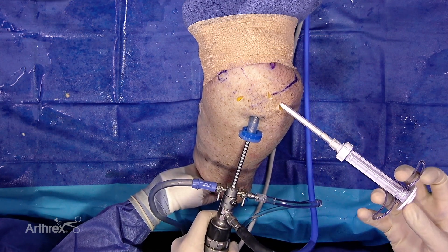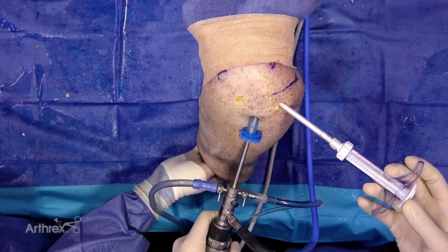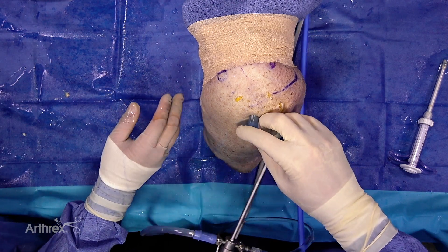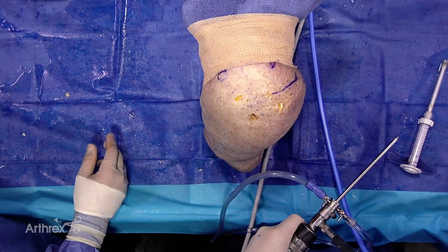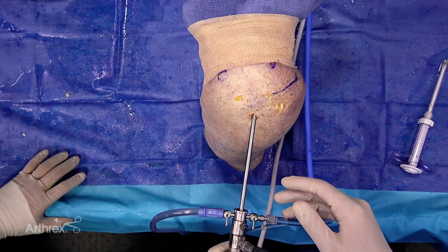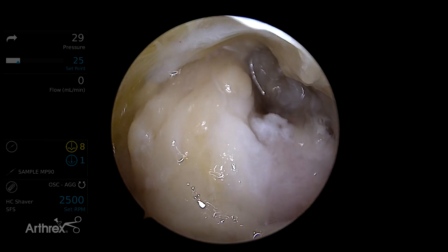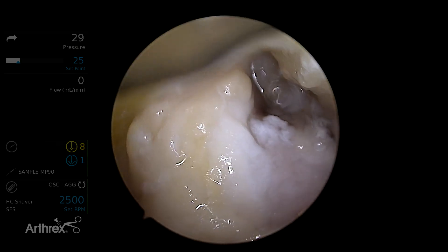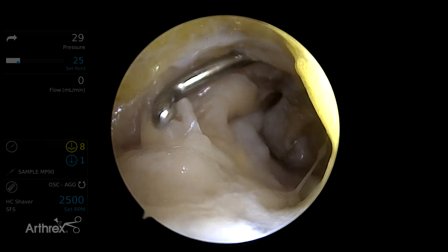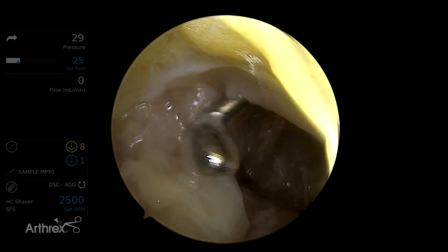I had a big amount of subacromial bursa — a large volume, approximately one cc. It fills up the space and kind of occludes my camera, but I know I'm in the right spot. I can withdraw this, then withdraw my camera and take my trocar out. The bursa stays in place. At this point, I don't want to put any more fluid inside the shoulder because I don't want to disrupt that tissue. If I stick my camera in, I can see that bursal tissue is stuck right on the surface of that rotator cuff repair — right there. It hasn't moved at all. I can see this is all the bursa tissue that we put back in. You can see how adherent it is; it sticks to everything inside of there, really coating that rotator cuff repair well.